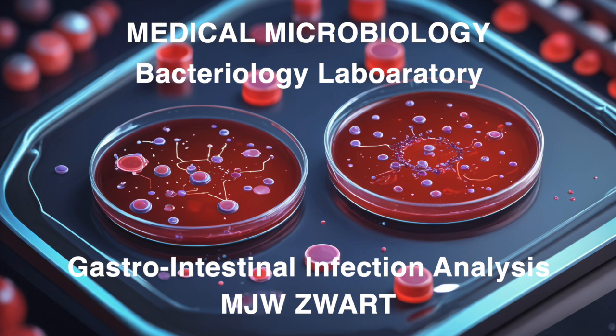Exactly. But what about those cases where we don't find the usual suspects or the patient's history suggests we need to look at other possibilities? That's where the algorithm gets really interesting. Gemini helped us come up with a way to decide which cultures we need based on the clues we have. For example, let's say someone just got back from a trip to the tropics and they've got watery diarrhea. We might think about Vibrio, even if the PCR doesn't show anything. Or, if there's blood in the stool, we'd need to consider Shiga toxin-producing E. coli. So it's a personalized roadmap, basically, right? Yeah. It guides us to the most likely causes based on what's going on with the patient.